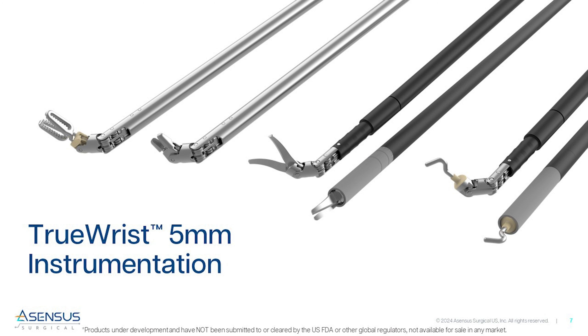A full suite of wristed and straight instruments, including our new true wrist instruments, which are a remarkable 5 mm in diameter.